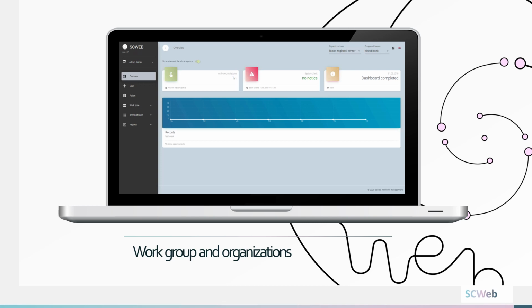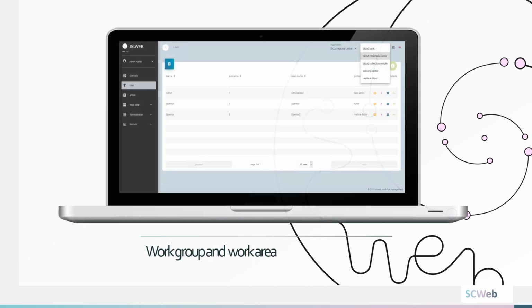The SCWeb system allows you to visualize the organization of every single work group per work area and per assigned process. The work groups are made up of healthcare workers qualified to carry out specific tasks in defined areas, such as clinics, distribution centres, processing centres and storage areas, wards and bedsides.